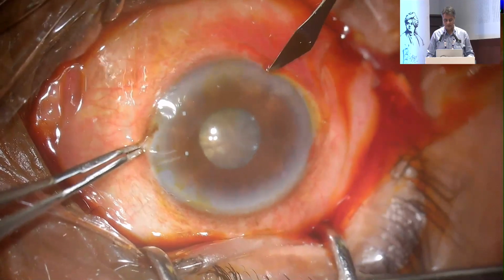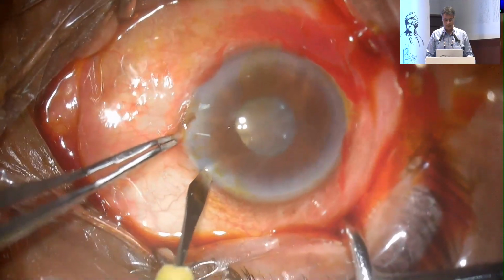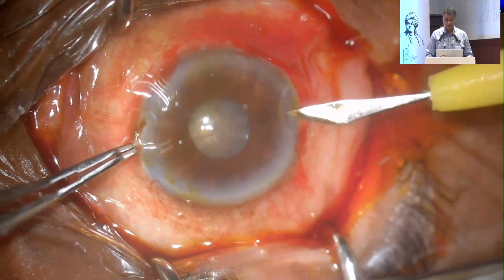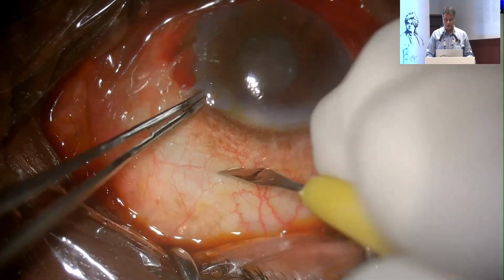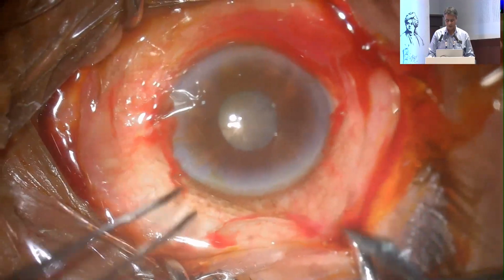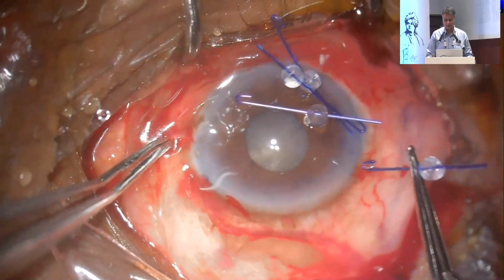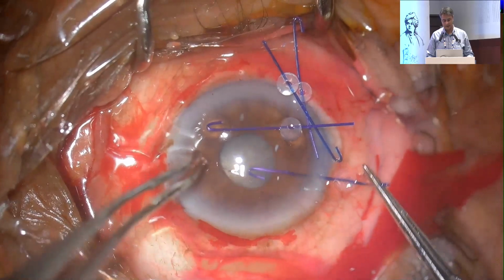And this is severe pseudo-exfoliation, non-dilating, rigid pupil, very mature cataract. So if you see, I make all my incisions right at the beginning. All this marking, everything I do right at the beginning. There's no viscoelastic, nothing at all. And then I introduce viscoelastic.